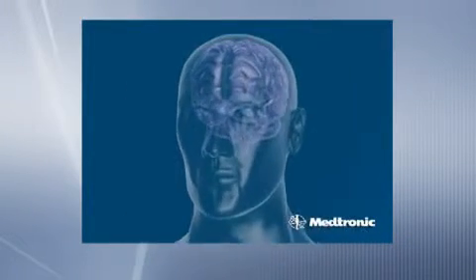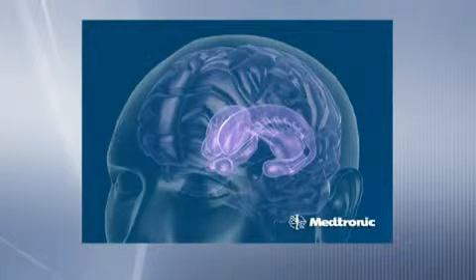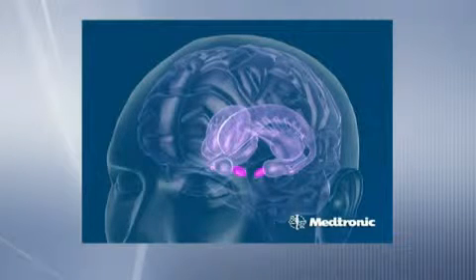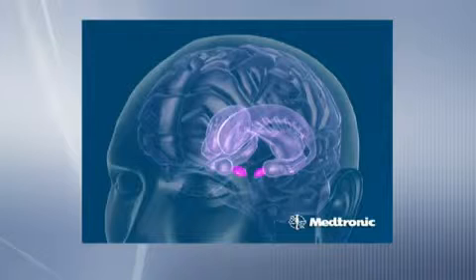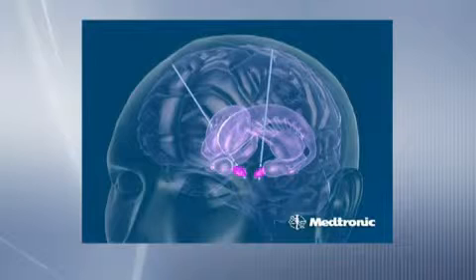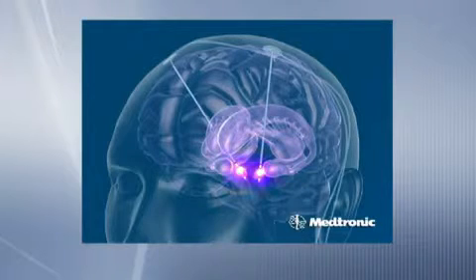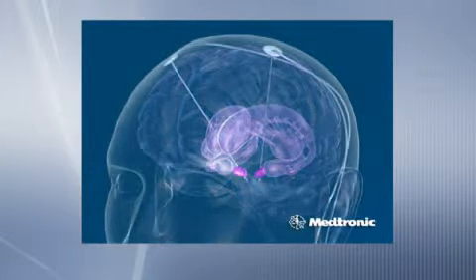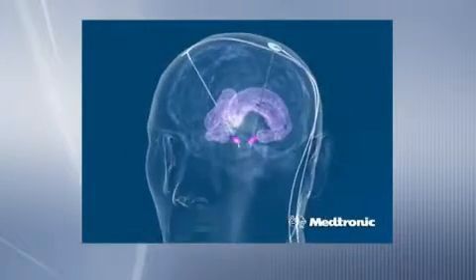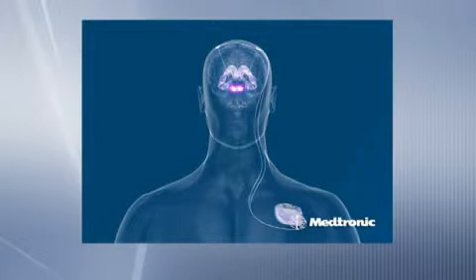Despite the fact that it's called deep brain stimulation, in most cases we're not actually stimulating the brain, we're shutting down areas of the brain. By delivering an electrical current which is a fairly high frequency current, the nerve cells in the area of the electrode stop working. And that allows us to fairly reliably and accurately shut down a small volume of brain around a particular part of the electrode. So even though we're delivering an electrical current, we're actually inhibiting the brain or shutting it down rather than stimulating it.